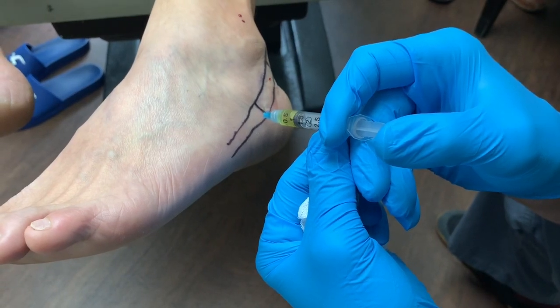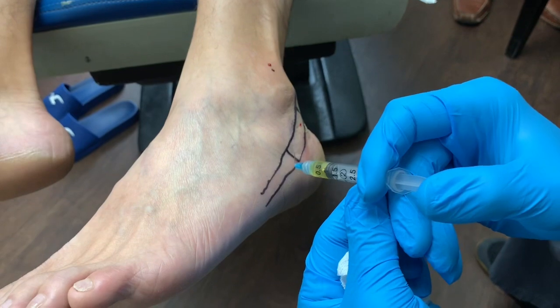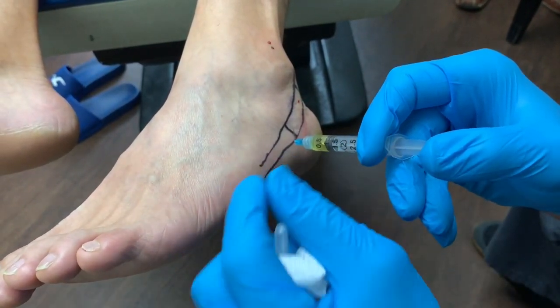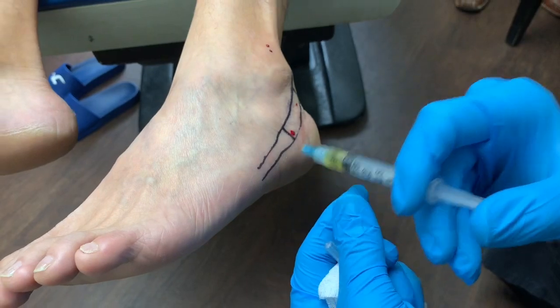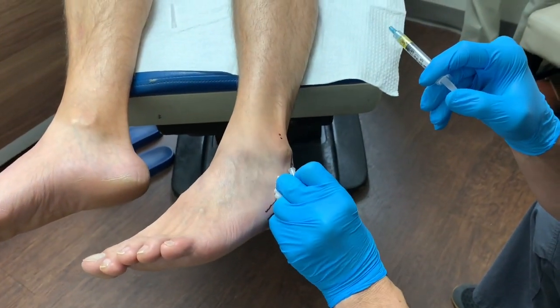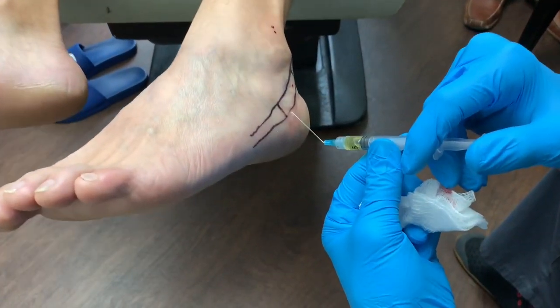Pressure but no pain. Good. If you have any pain, please let me know. I just want everyone to know — it's a very fine technique. I'm not jamming the needle into the tendon. We'll just do a little bit more here.